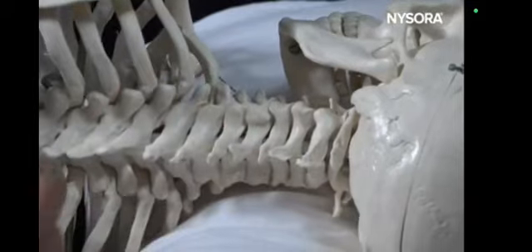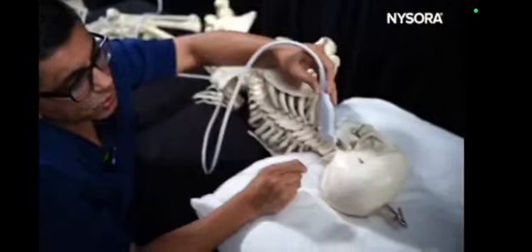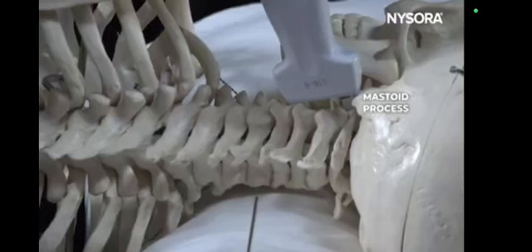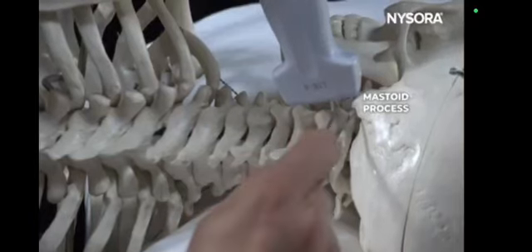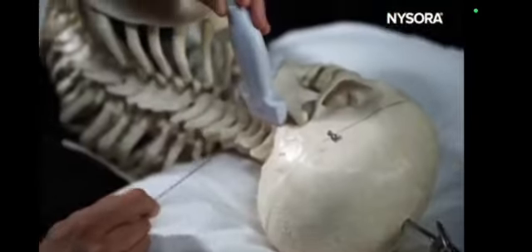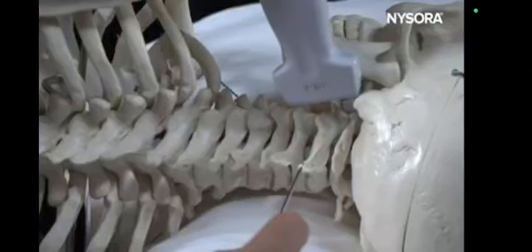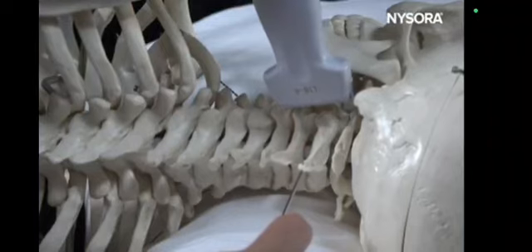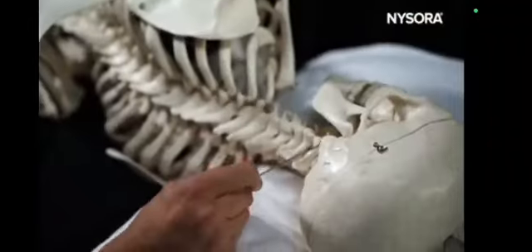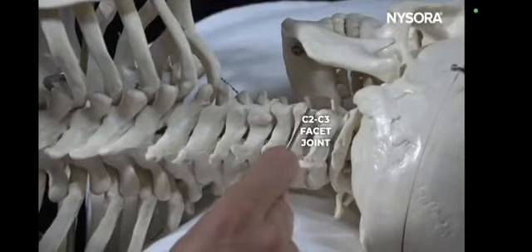The starting point when you use ultrasound guidance for the cervical medial branches is usually the mastoid process. So you put the ultrasound on the top of the mastoid process and you look for the sternocleidomastoid muscle, which is basically inserted on the mastoid process. Once you have done that, you go about half a centimeter below and anterior, and then you will start to see the first joint, which is the C2-C3 joint.